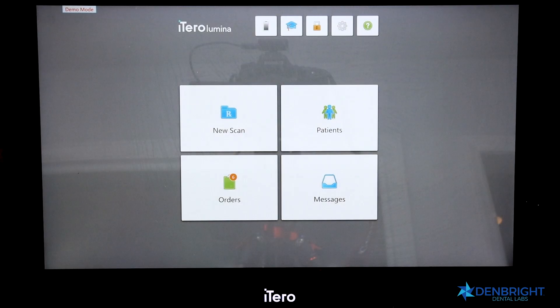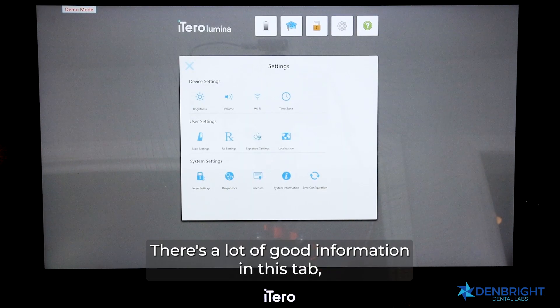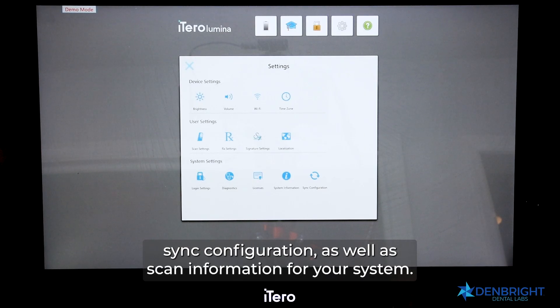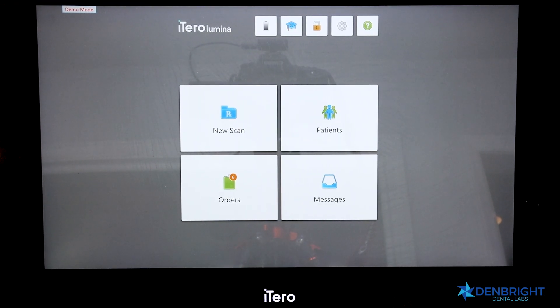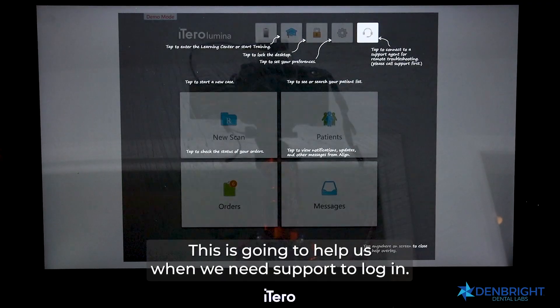Our fourth icon is the Settings tab. There is a lot of useful information here, such as how to input your Wi-Fi, change your brightness, sync configuration, and view scan information for your system. Our final tab is the Question Mark, which helps us when we need support.